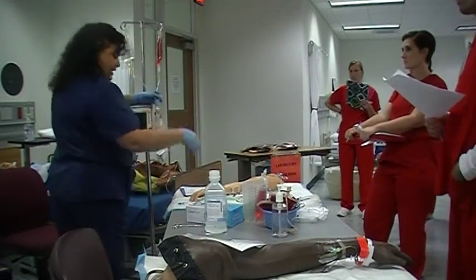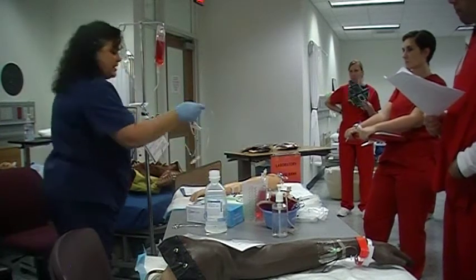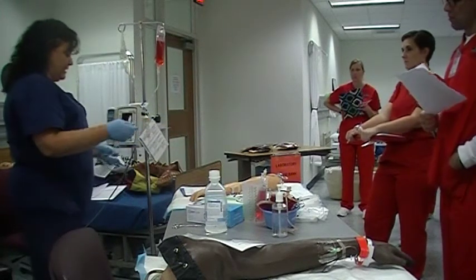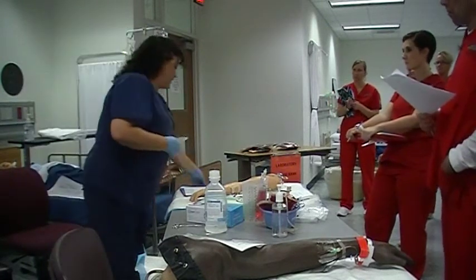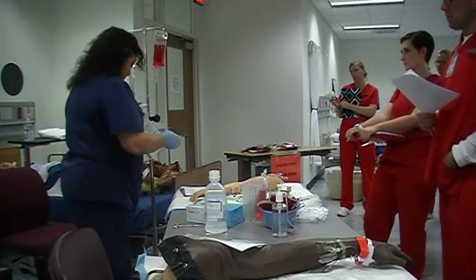We want to open the blood, and we want to run it through the tubing so that when we go to put it on the pump, the blood is already down here. Otherwise we're going to have to wait even longer for it to get to the patient before we start our 15 minutes.